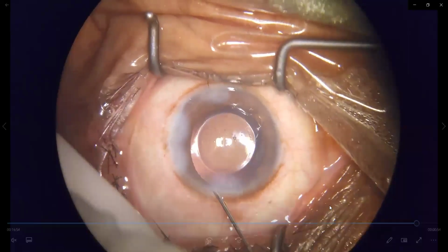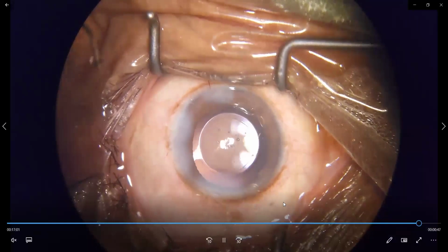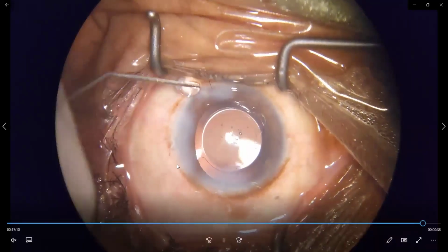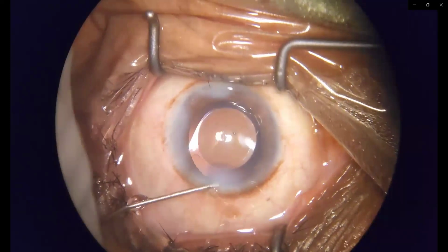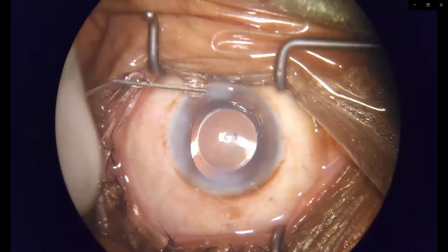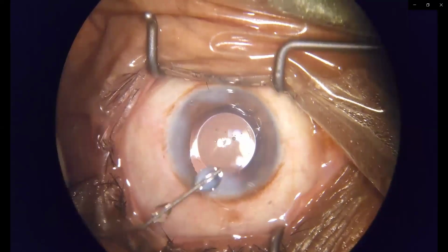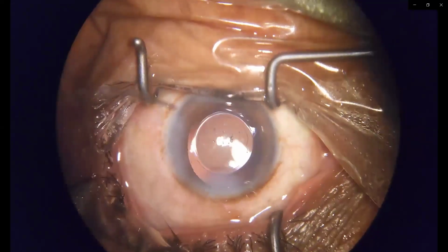So here you can see, Shalab, why don't you put the cartridge inside the chamber instead of wound assisting? What is the harm if you push it inside? Just to keep the wound at 2.4, to maintain the wound structure probably. That is the only advantage. Otherwise, I think it is always safe to push the cartridge in the anterior chamber and then push the lens. He wants to save a few millimeters, and to justify himself that he is preventing astigmatism, he is inducing less astigmatism.